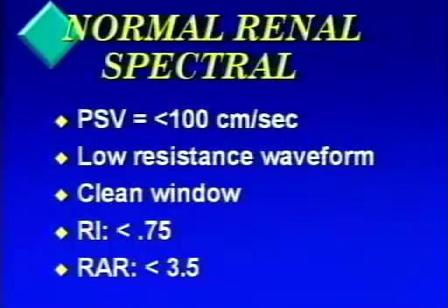Okay, so we talked about what view we're going to be evaluating these patients in. We have the choice of a supine transverse scan plane. If by chance the patient is obese, which many of our renal artery patients are, or they have a significant amount of bowel gas that's interfering with your examination, an alternative view would be to roll the patient up into an LPO position and go for the banana peel sign to evaluate the origins of the vessels. But in order to interrogate the remainder, the mid and distal aspects of the main renal artery, you would again have to put the patient back into a supine position.